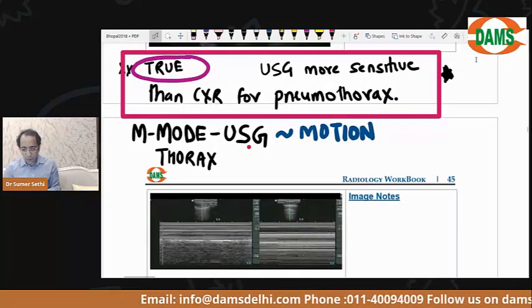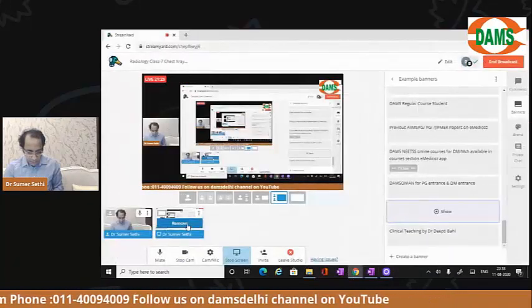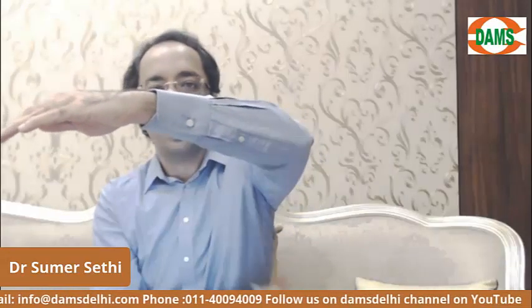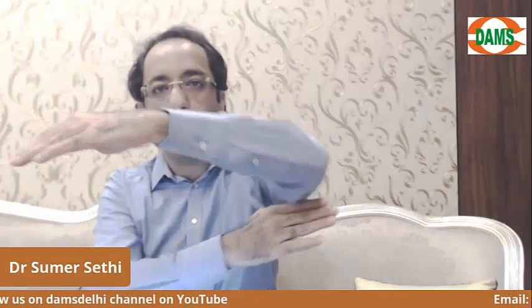Suppose this is your chest wall and this is where you have your pleura. So with respect to the chest wall, the pleura is showing sliding movement. That means with respect to your chest wall, the pleura should have sliding movement. Now listen to me and answer. If there is a pneumothorax here, what will happen? The lung is collapsed. Now you will have no sliding movement here.